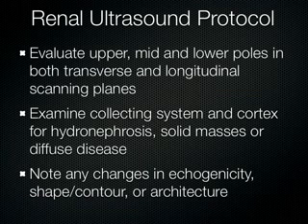All right. Now, when you look at the kidneys, you want to think about the upper and the lower poles. The way I think about it is upper means towards the head, or superior, and the lower pole means down towards the feet, or inferior. In between the upper and lower poles is the mid pole. That's really all you've got to know. You can look at them in their long axis, and then flip the probe 90 degrees and look at them in their short axis.